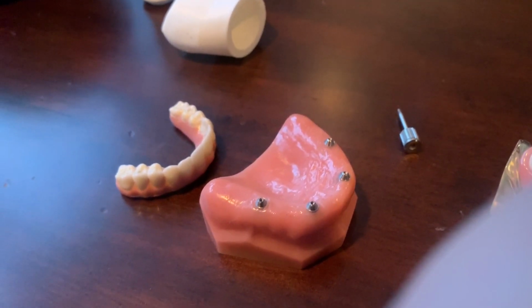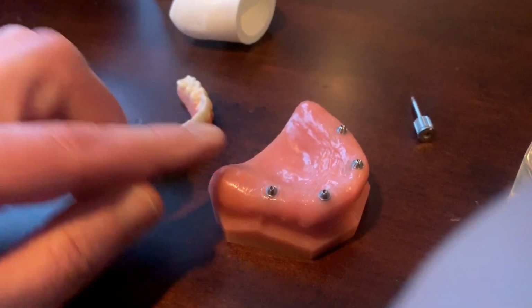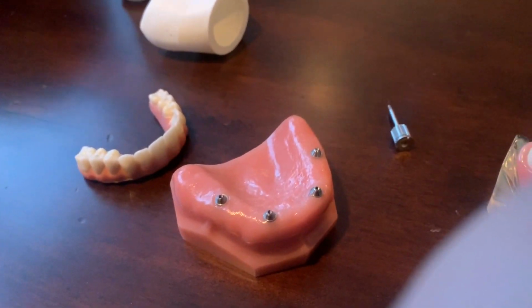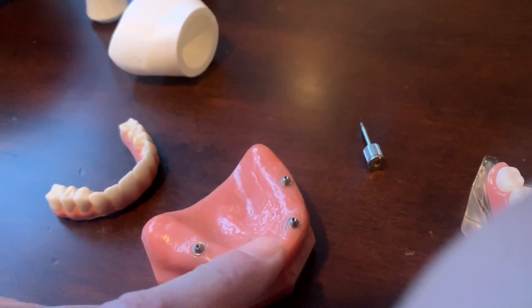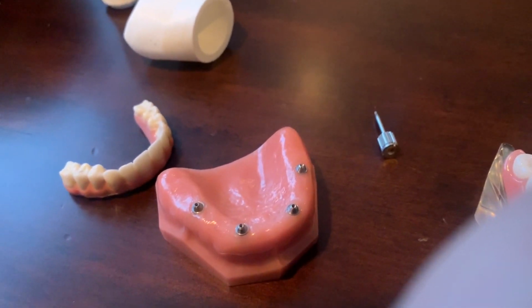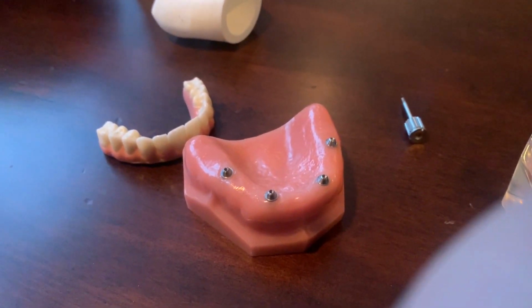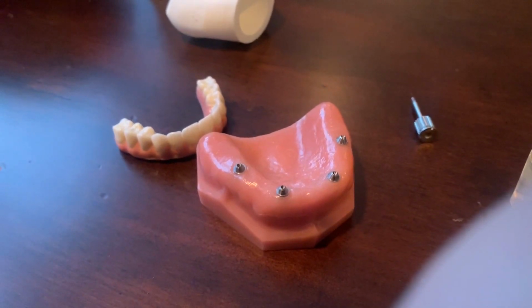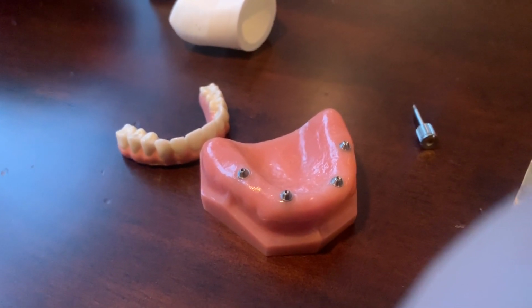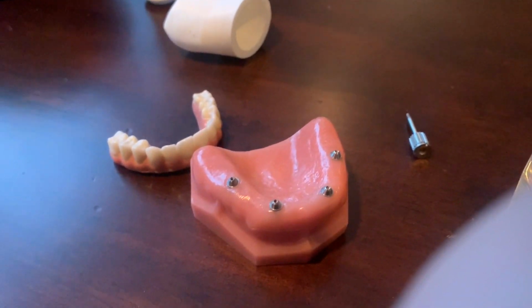For people that are just recently losing teeth, instead of getting this one-piece bridge, we can put in 3 individual implants here, and the same thing on the other side in the back, and we can put individual teeth for the back teeth, and then we can put small bridges here across the front. People can have areas where they can floss, and there's not anywhere near as much pink here. So I offer this other option called full mouth of implants and crowns. It's basically implants that connect small bridges and crowns, and you can literally have probably 10 implants and have as many individual teeth as possible in there.